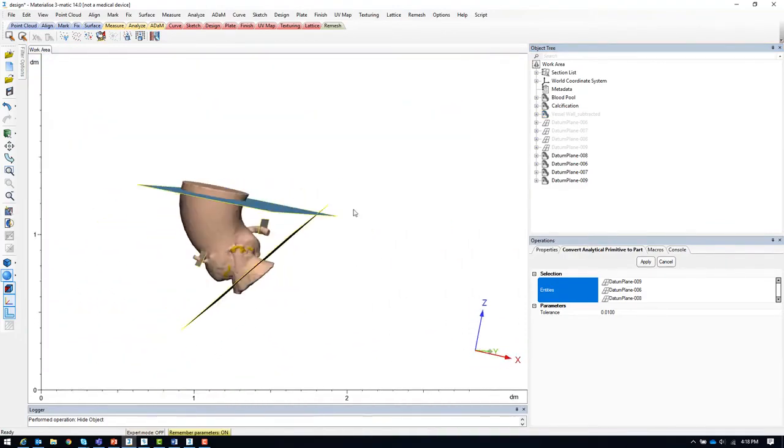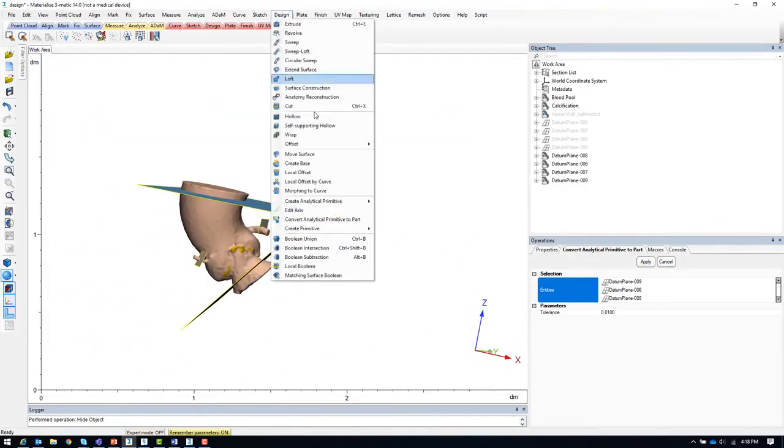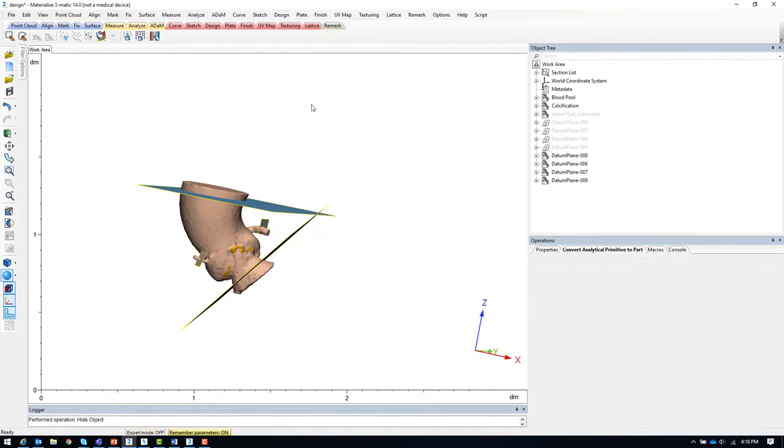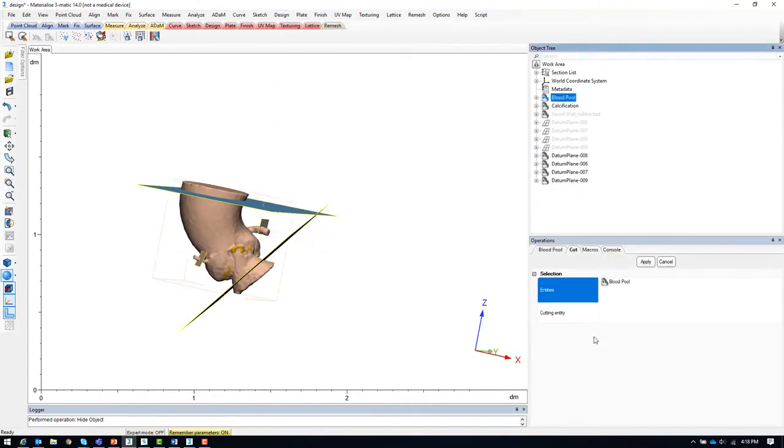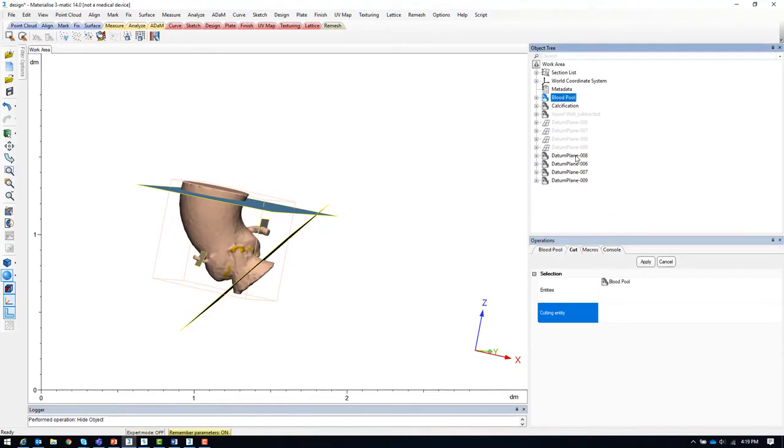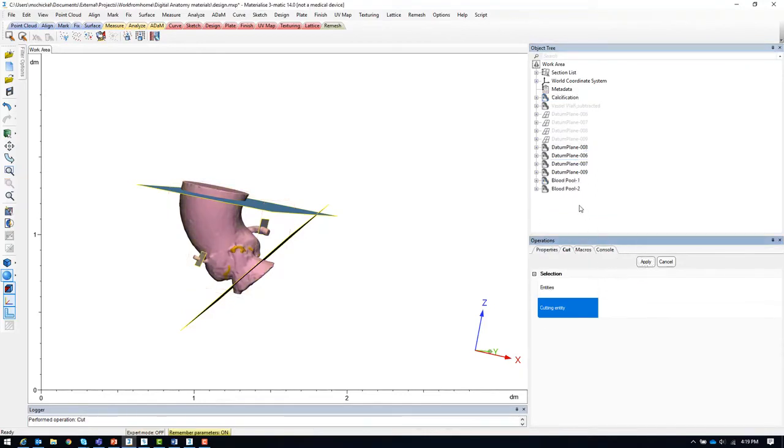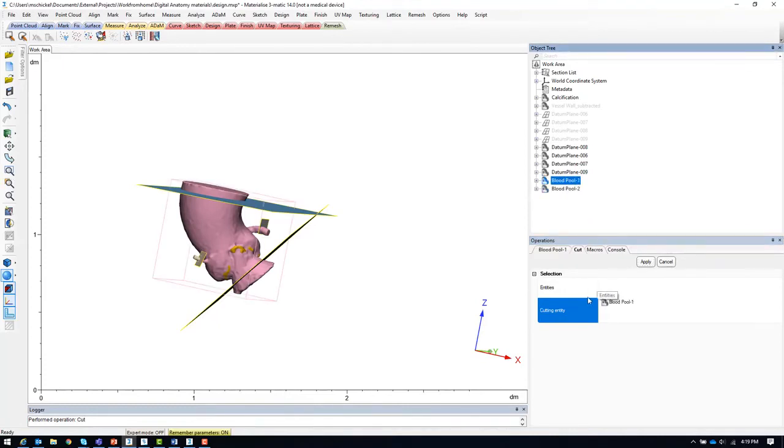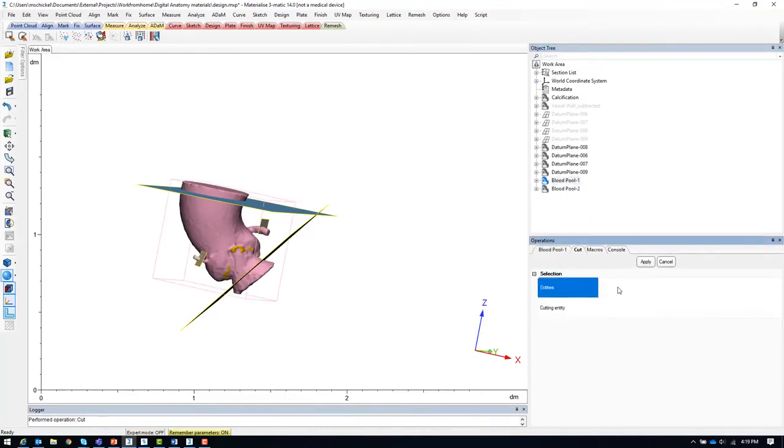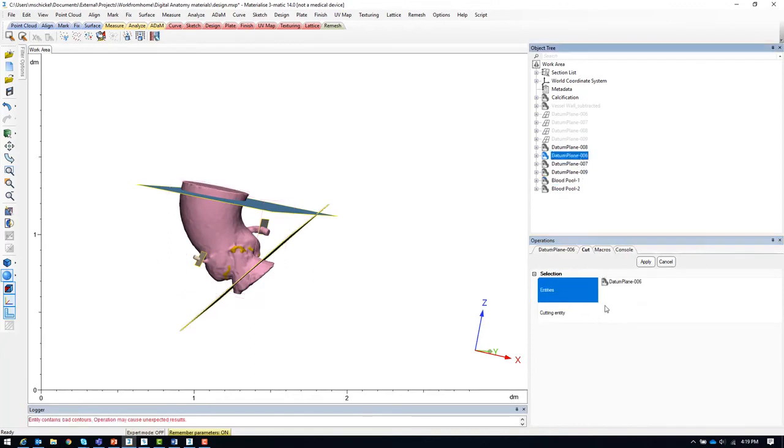To perform the cutting, we will use the cut tool, selecting the blood pool and one of the datum plane surfaces at a time. This will create two new parts. We'll throw out the small one and continue cutting the larger of the blood pool parts with another datum plane surface.